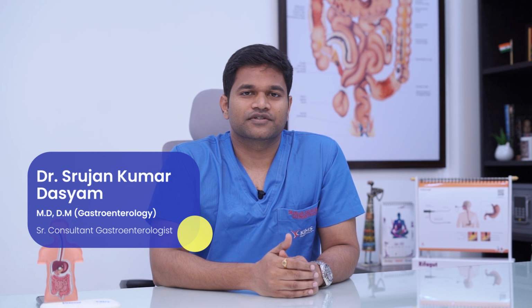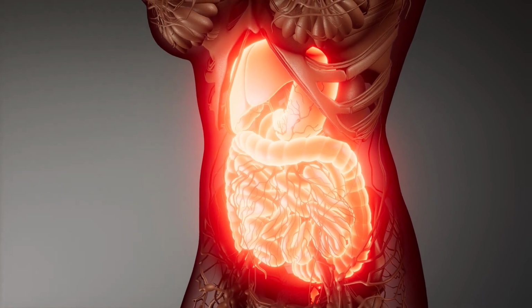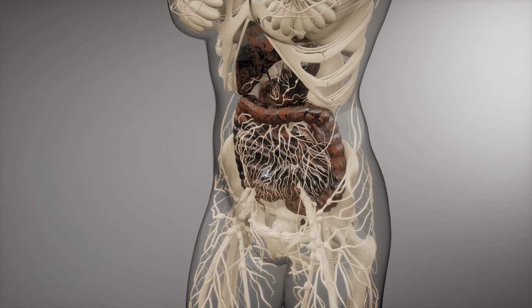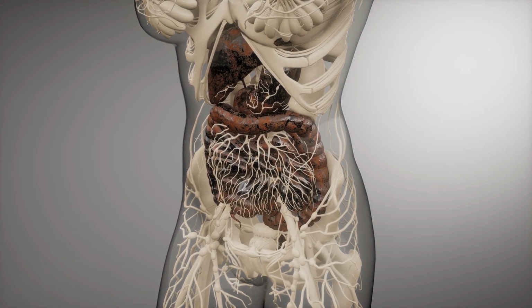Today we will briefly discuss upper GI endoscopy, or UGI endoscopy, which is one of the most widely used tools in the field of gastroenterology across the globe. So what is the upper GI tract? In our digestive system, the upper GI tract includes the food pipe, which is called the esophagus, the stomach, as well as the duodenum. And in an upper GI endoscopy, it is visualized till the proximal part, or the initial part, of the duodenum.